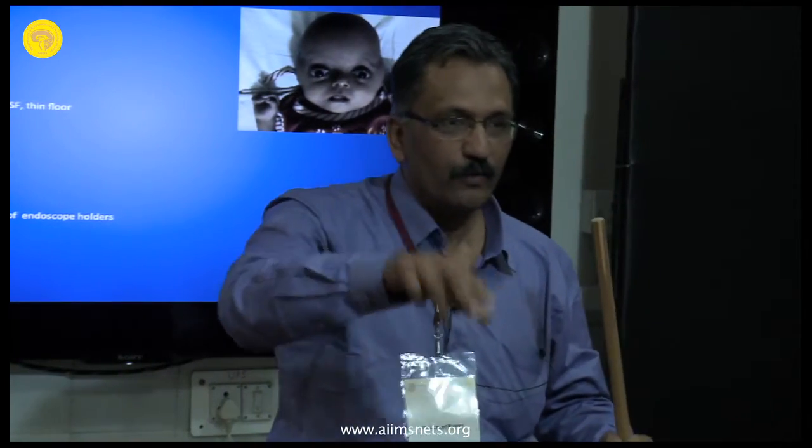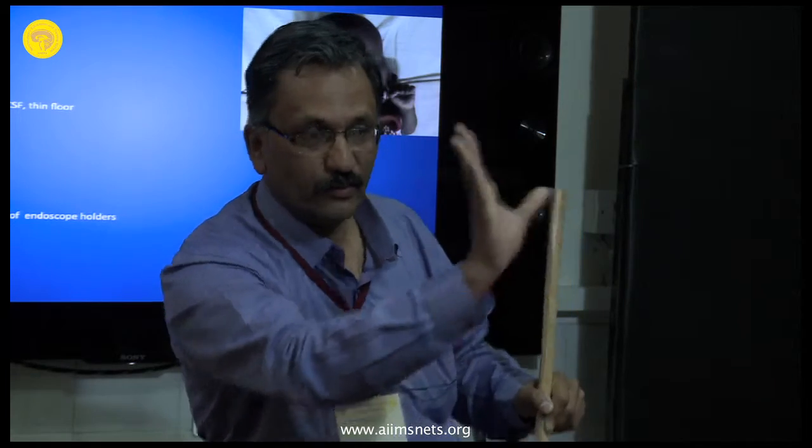That way you get a wider field, and it's easier for him to reach that point. Once you reach the point, then he will not move the instrument. You will take it down. He has no experience. He is only seeing a two-dimensional view. What you need to do is to take the endoscope there and guide him there.